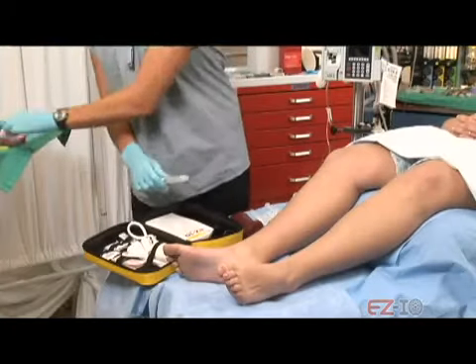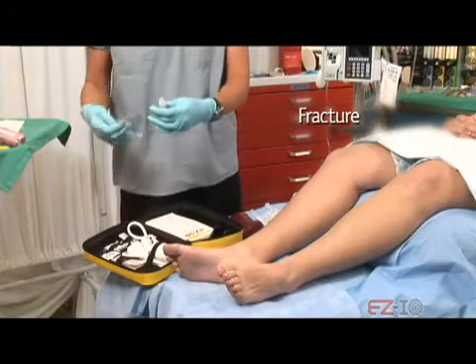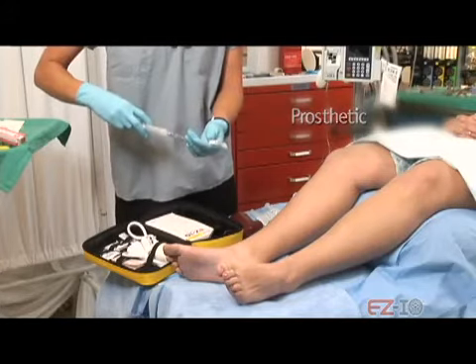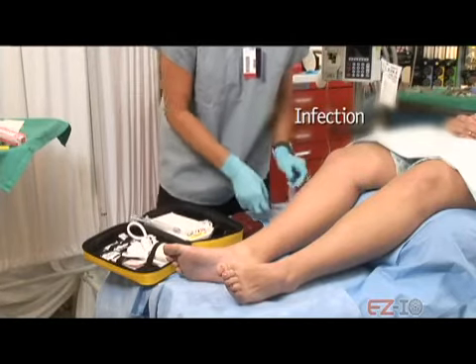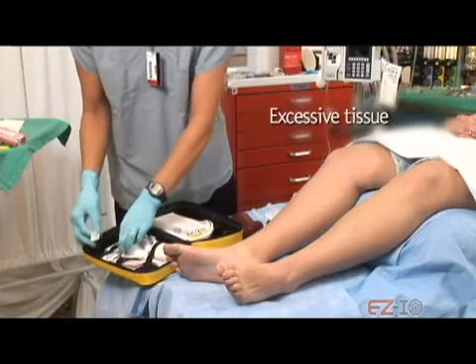The following are contraindications for EZ IO access: a fracture on the targeted bone, previous orthopedic procedures near the insertion site, a prosthetic limb or joint, IO has been used within the past 24 hours on the targeted bone, infection at the insertion site, or an inability to locate landmarks or excessive tissue.